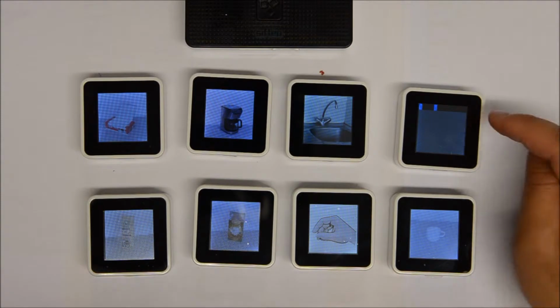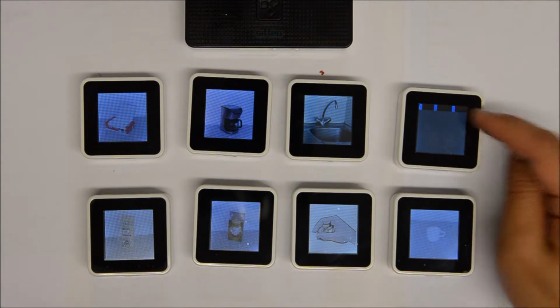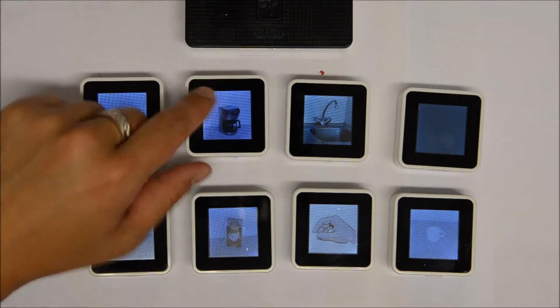You see here, the task has not been started. To start the task, press on this 3 times. You see the progress bar here, and then the task will be started. The first action will be to open the cover of the coffee machine. If you don't do anything for 10 seconds, the system will remind you. This is the first level reminder. It will just speak out the audio, saying open the cover of the coffee machine.